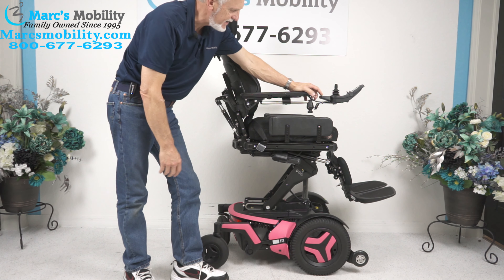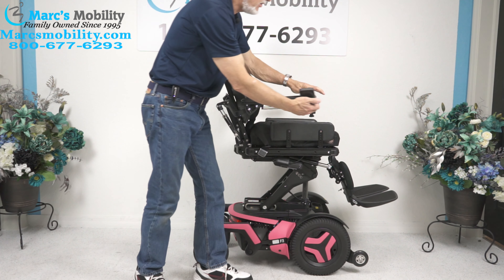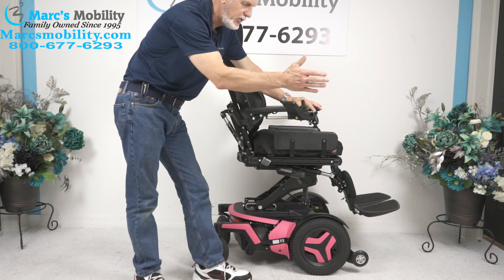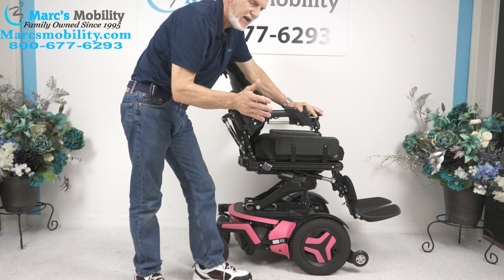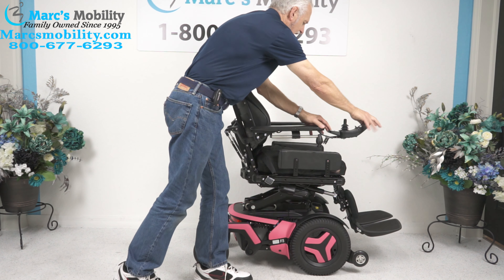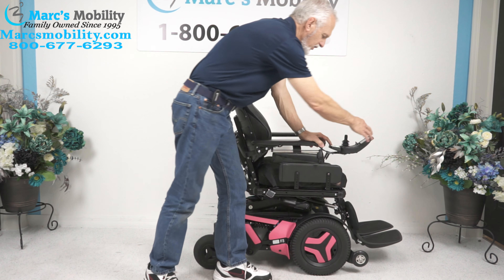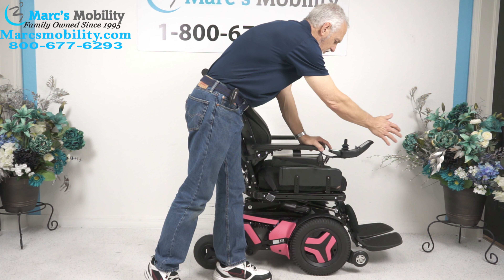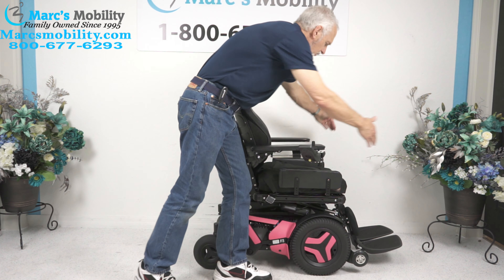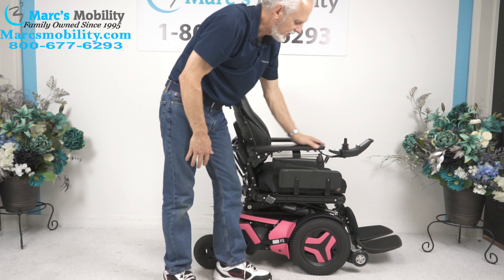So far we've covered the 12-inch seat lift. This chair also has what's called a swing-away joystick. If you're right-handed, it's already swinging to the right. But if you're left-handed, we can transfer this joystick all the way to the left side and it'll swing to the left side. This is called a swing-away joystick, which is nice — you can get closer to your dining table.